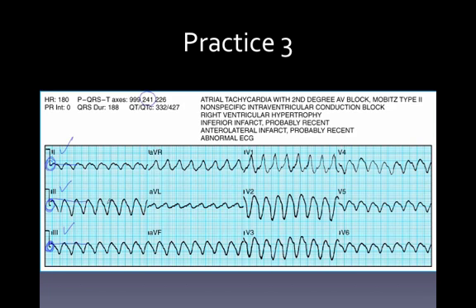Now that is a pattern for ERAD. The machine came up with 241, so let's look at that. That's because it saw multiple focal areas here.